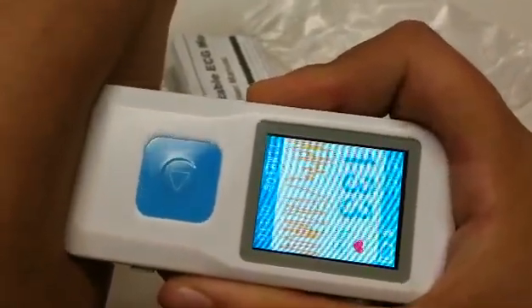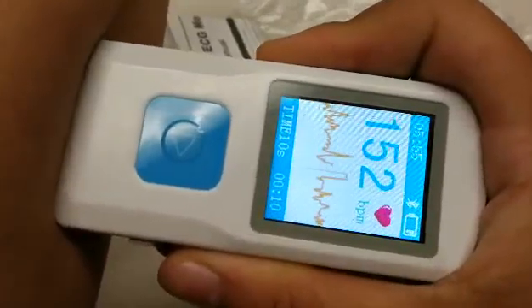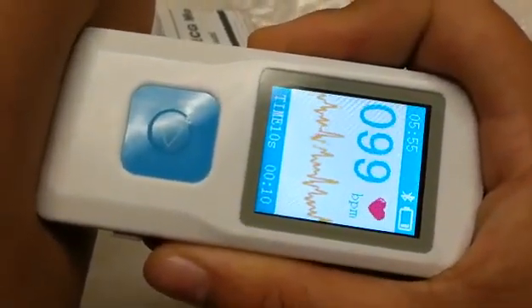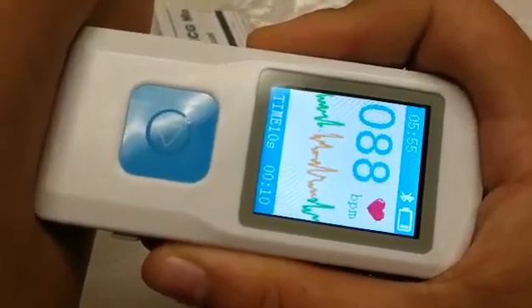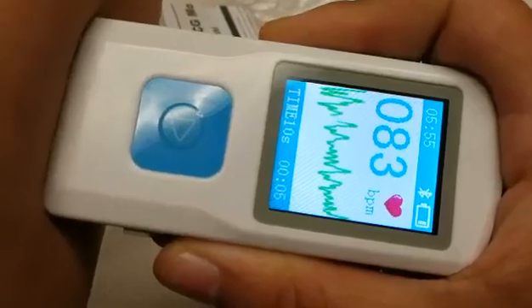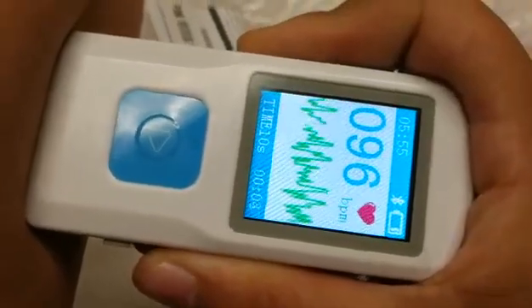The device will not begin to get a reading until the waveform has gone from orange to green. This item can detect missed heartbeats, early heartbeats, or arrhythmias.